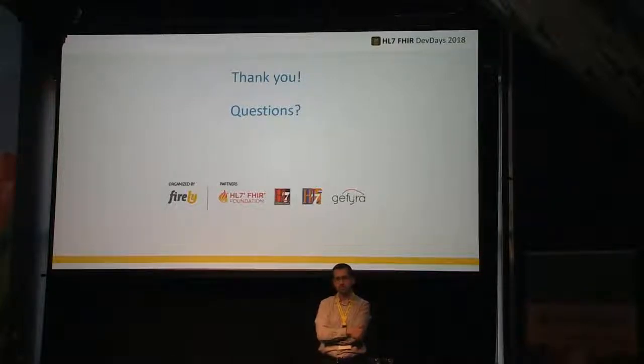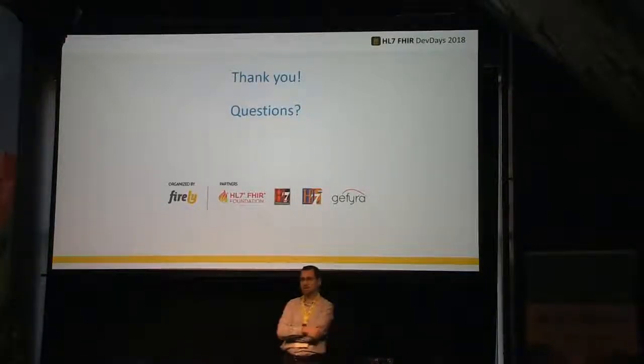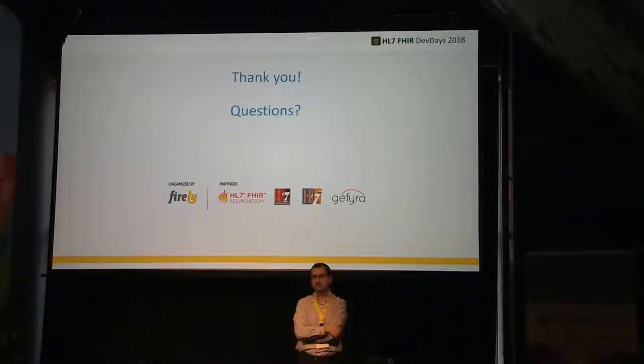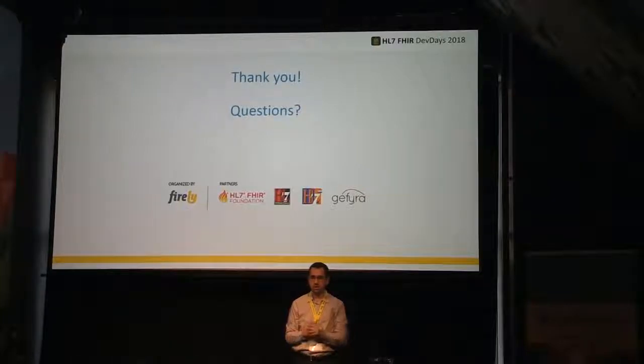Hi, just a question about de-identification. In terms of making DICOM images available for research use, what kind of tools have you used or would you recommend for image de-identification? Image de-identification is a very, very wide topic and relatively complicated. The good news is there are tools. The bad news is none of them are perfect. A lot of things are done sometimes that are weird, because it's not just scrubbing the data in DICOM, which by itself is a problem, believe it or not, because sometimes de-identifying the data may actually break the consistency of the data. So that's one.